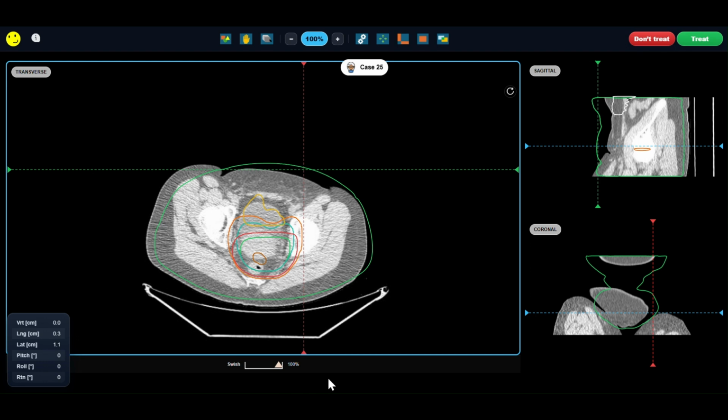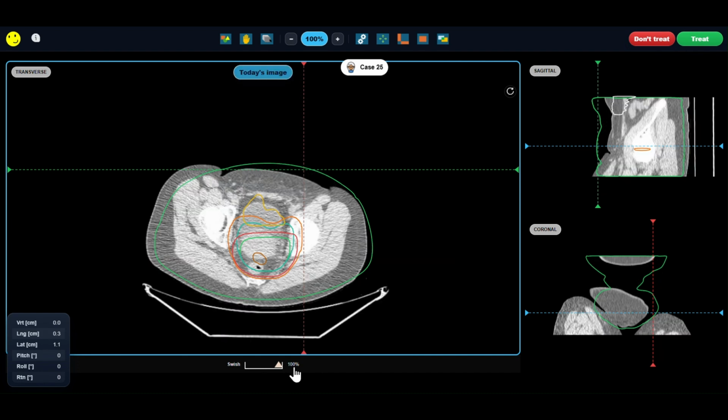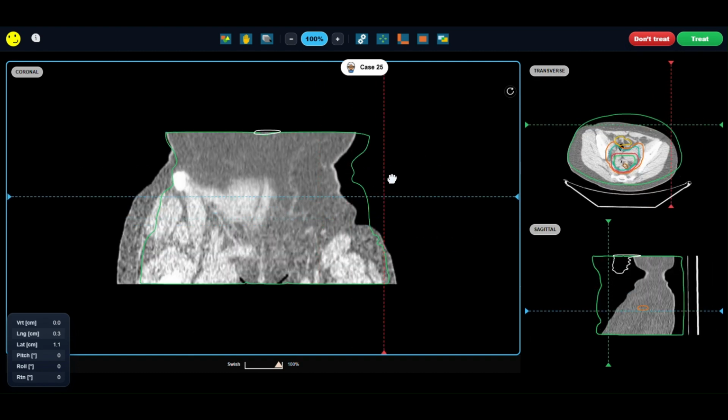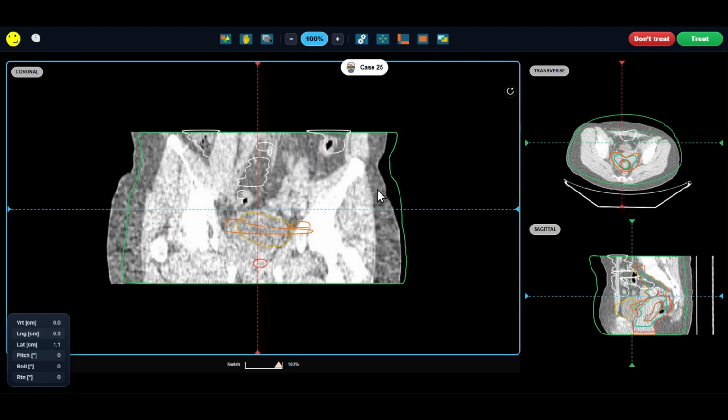And as we mentioned earlier, we are proceeding with the VMAT plan, which means that any changes in anatomical position and any contour difference can severely impact the dosimetric effect of the treatment. Hence why, by just a first glance, we can safely say that we can take the patient off the bed and we can reposition them.